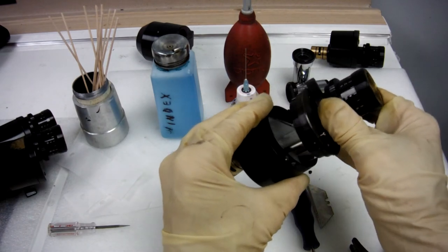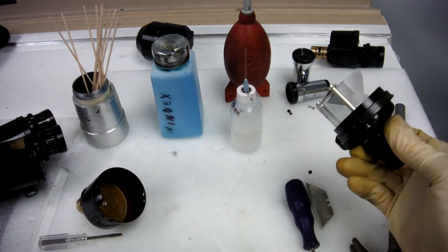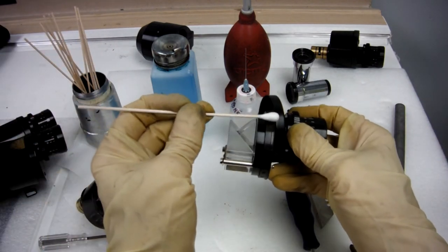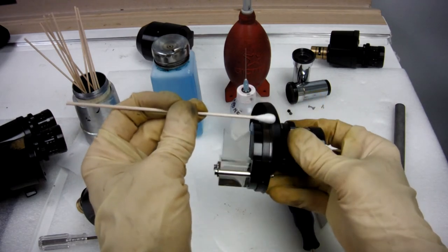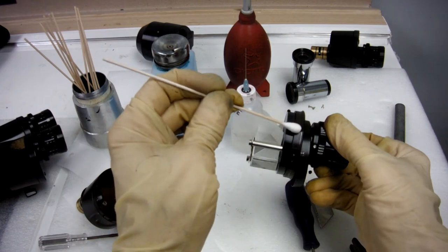Once it's broken loose, you can pull it out. Be sure to clean the residue of Loctite that's around the edges with acetone.